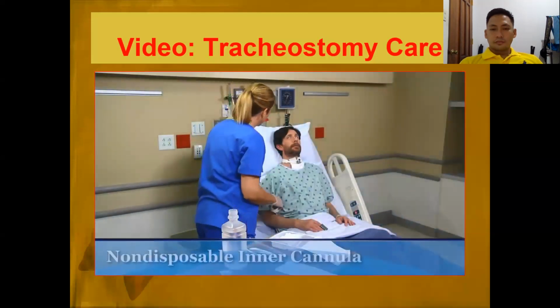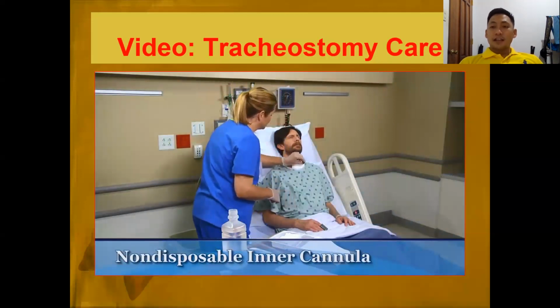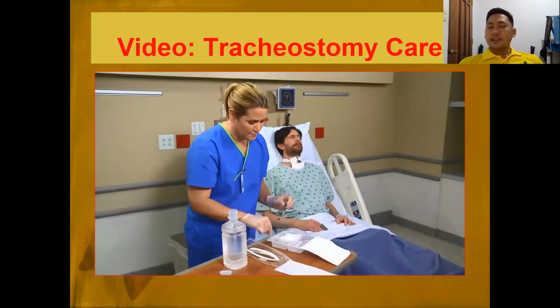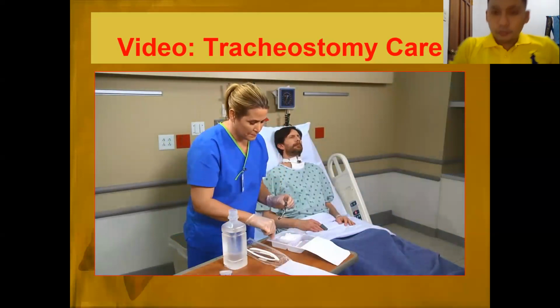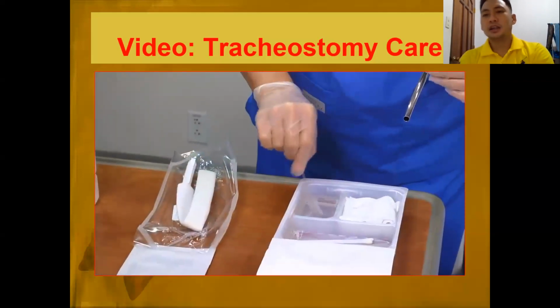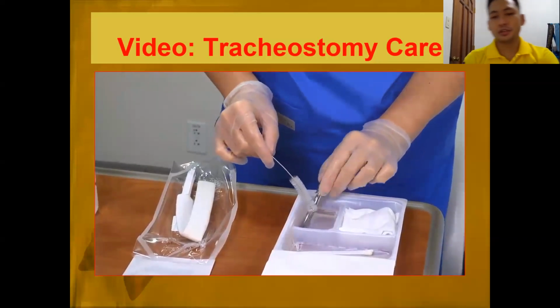I'm going to clean out your inner cannula. That is if the inner cannula is not disposable. You need to clean it. When it's disposable, it's more convenient because you just throw it away and replace it with a new one. You don't need to clean anymore. But of course, it's more convenient for the patient, especially economically, when the cannula is reusable. So we'll just be cleaning it.